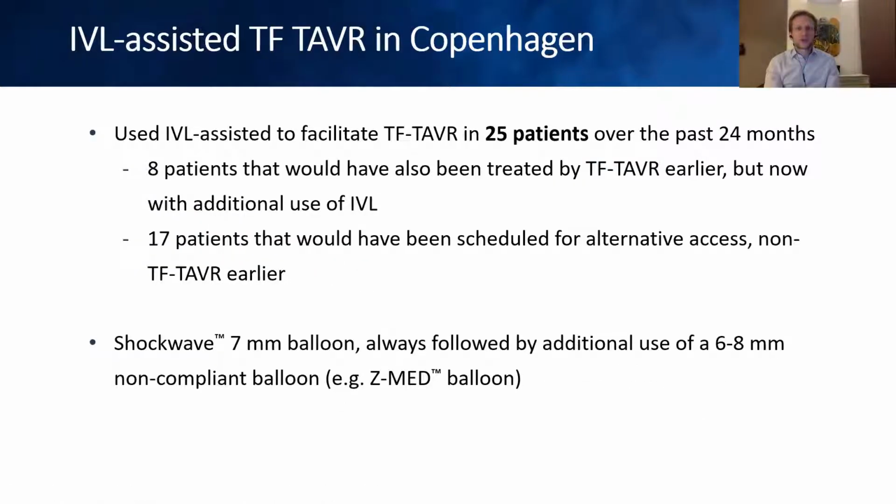So what is our experience in Copenhagen? Over the past 23 or 24 months, we have used this technology in 25 patients. 8 patients we have used it in would also have been treated by transfemoral approach earlier, but now with the additional use of intravascular lithotripsy, we think we could diminish the risk of complications. And if we talk about complications when pushing the borders in transfemoral approach, we're talking about the risk for vascular rupture, or the risk for nasty spiral dissections, or dissections which can evolve into thrombosis.